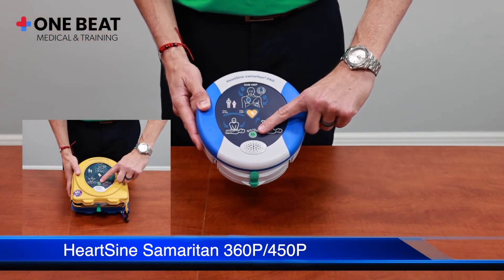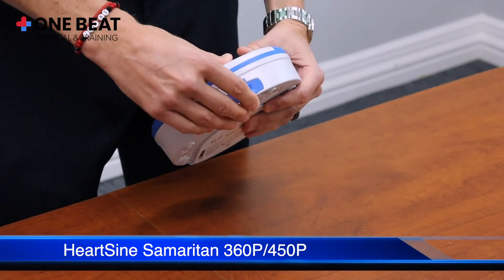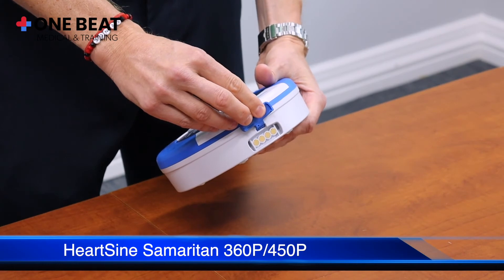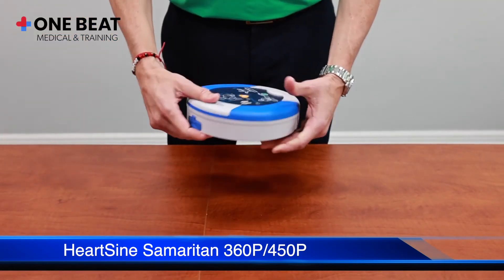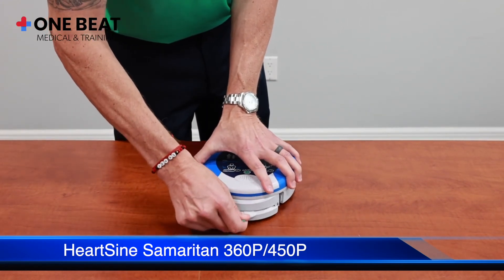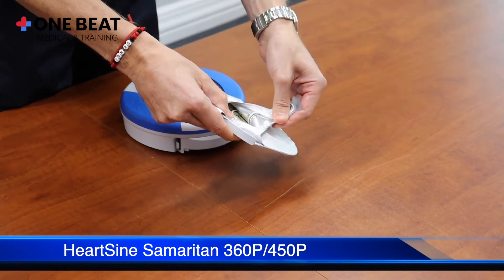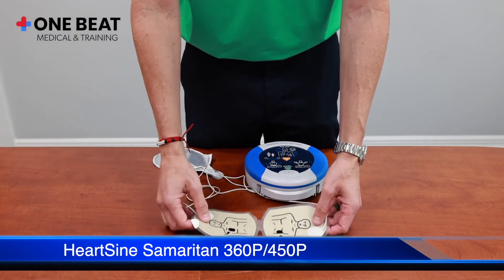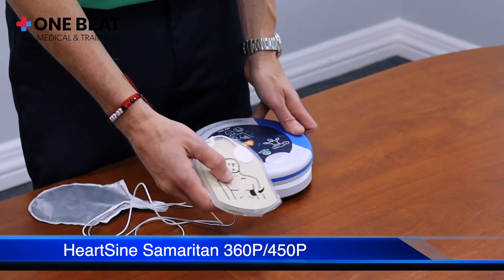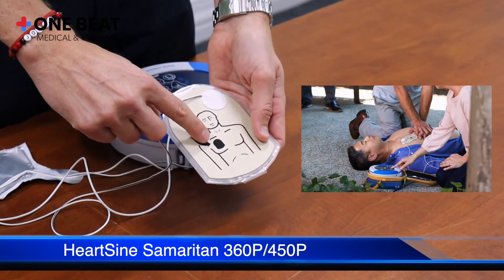You turn the machine on using the on/off button. To download an event from the machine, you use the portal on the top side of the AED. To expose the electrodes, pull the green tab and it pulls out a tray. Each electrode has an image that matches the image shown on the AED — this electrode is placed in the lower left, and this electrode is placed in the upper right.